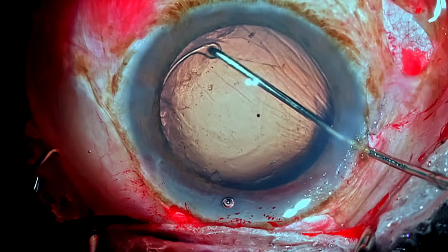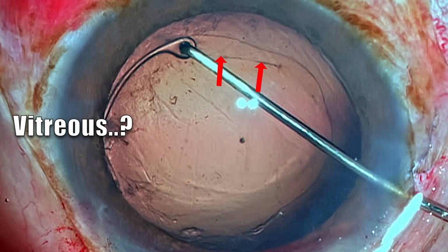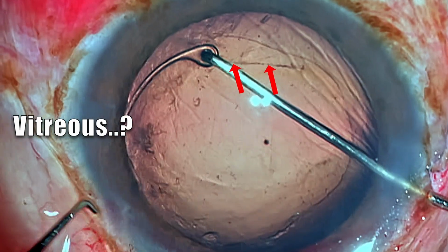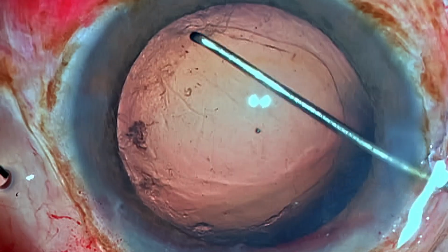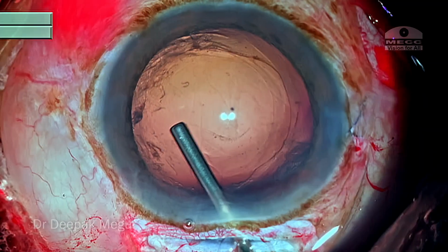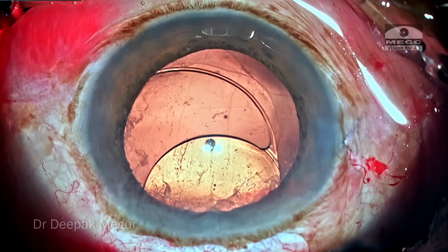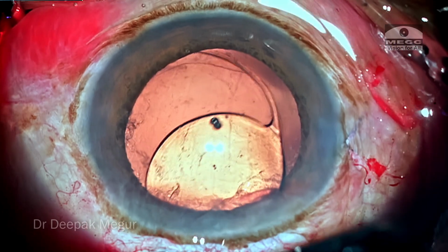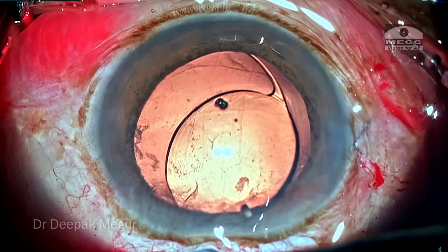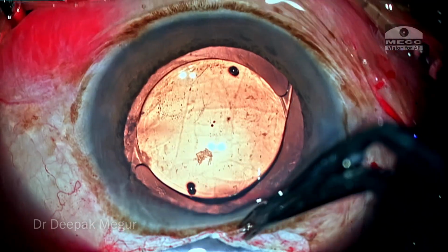But as he was maneuvering, I thought there was a strand which was being tugged at, which could possibly be vitreous, we don't know. But still, it doesn't look very obvious for the trainee surgeon. So he's now going in with implanting the PMMA lens. As the PMMA lens is being introduced, again we can see a strand which is trying to come into the central area from the periphery.